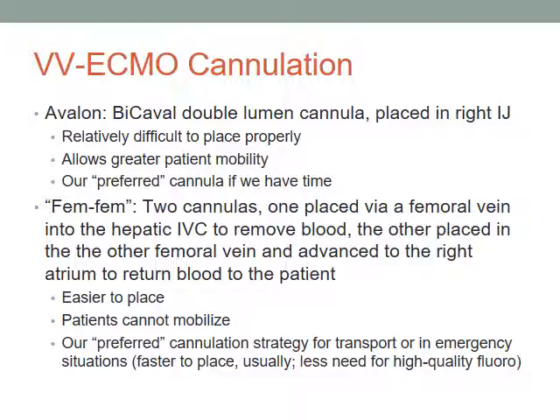We miss the blood that's in the SVC. So we're going to have some SVC blood that is going to mix with our ECMO circuit blood, okay? This is easier to place. The anatomy is more straightforward, less to go wrong, very quick. We can do it in a transport situation.